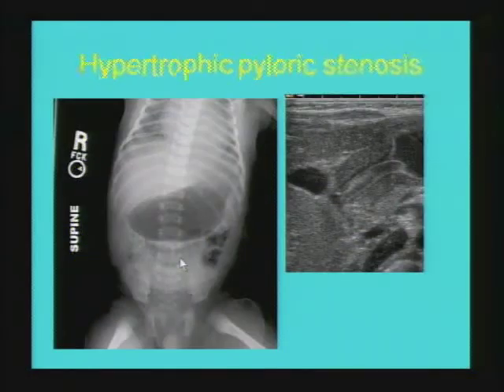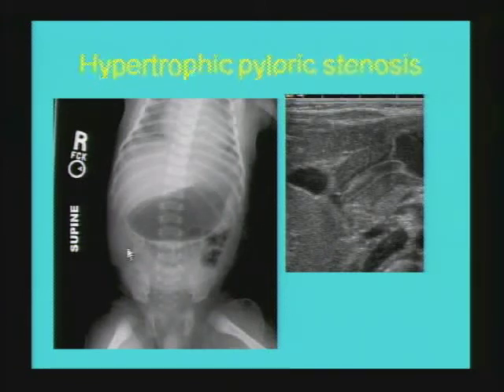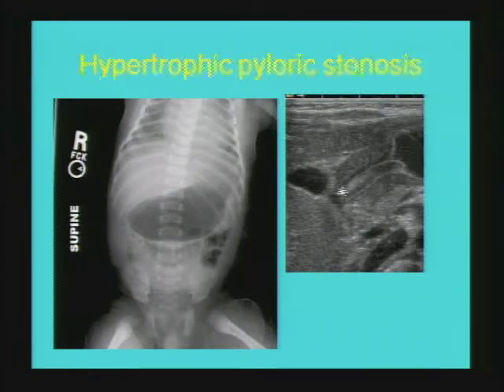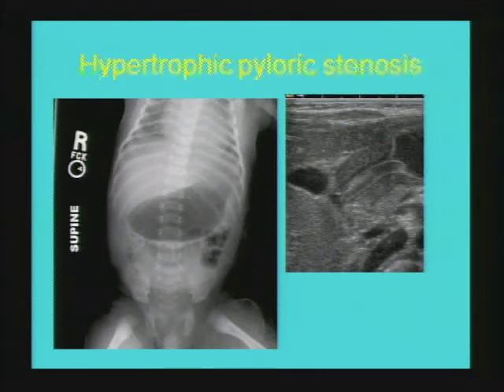This plain film in a patient with hypertrophic pyloric stenosis presenting with projectile non-bilious vomiting shows a fairly nonspecific appearance — distended air-filled stomach and nonspecific distension of bowel segments. Ultrasound at the level of the pylorus shows thickening and elongation of the pyloric channel. Individual muscle thickness greater than 3 mm has high sensitivity for diagnosis, and pyloric channel length greater than 15 mm is a sensitive criterion.